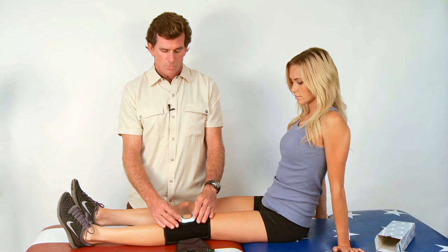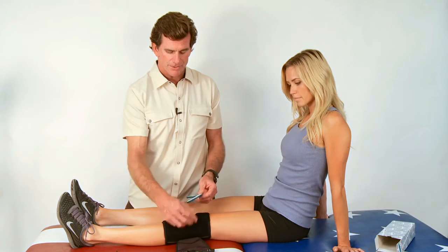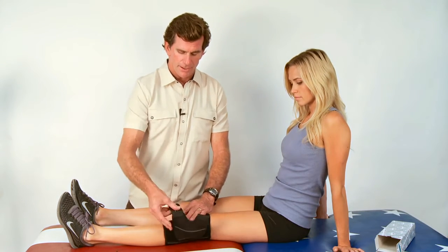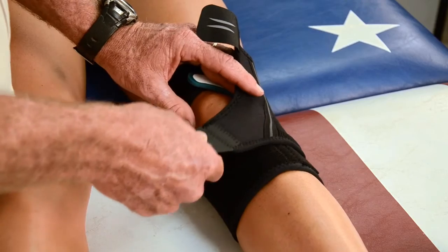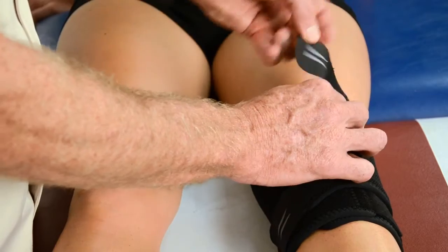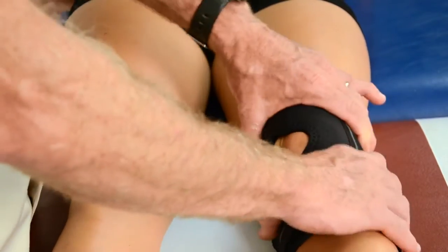Once I evaluate the patella, I'm concerned with which of the two straps to put on first. Given the clinical diagnosis, I would choose an inferior strap when the apex was the more movable component that I was trying to correct. So then the application is the same, pulling at a lateral 45 degree, then you can reset the buttress, reset the force on the patella, and then apply it with the same 45 degree angle.